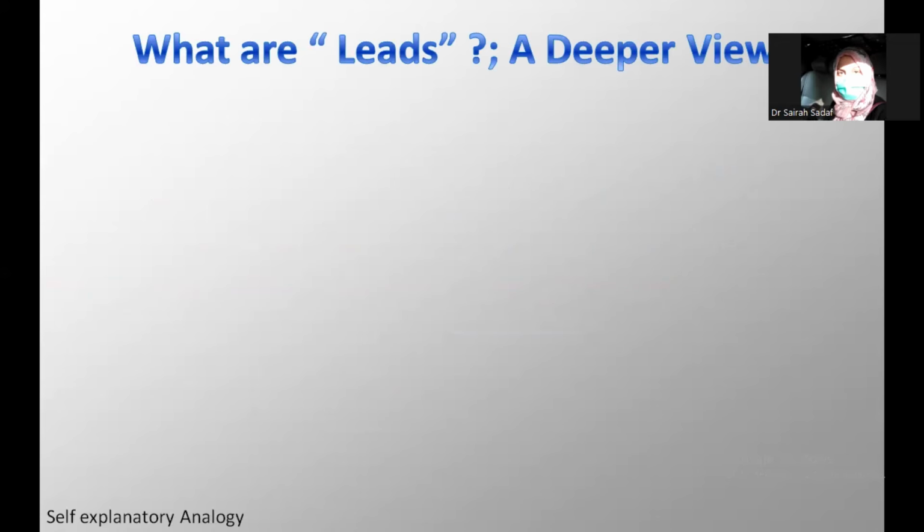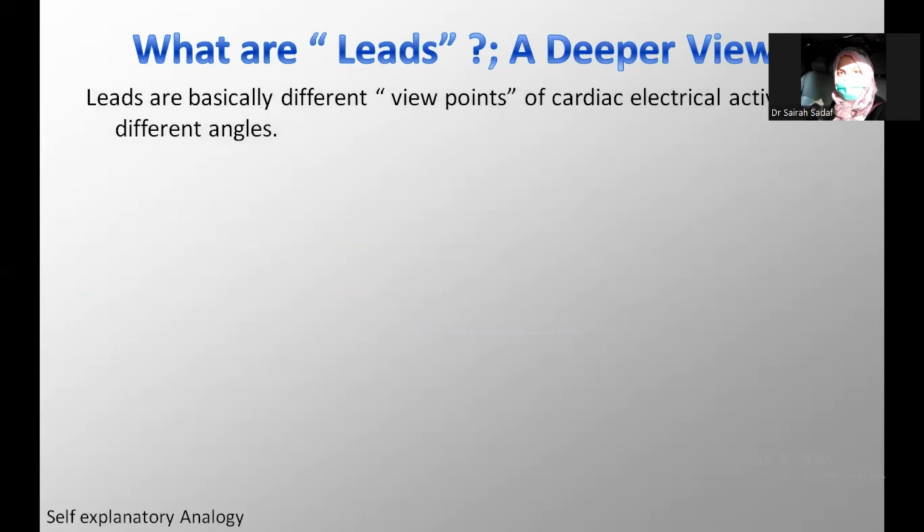Now this is a bit of a deeper concept. First of all, let me define it, and I will try to simplify it as much as possible. Leads are basically different viewpoints of the cardiac electrical activity at different angles. It simply means that you are looking at the electrical activity of the heart from different angles. I hope it's making sense.